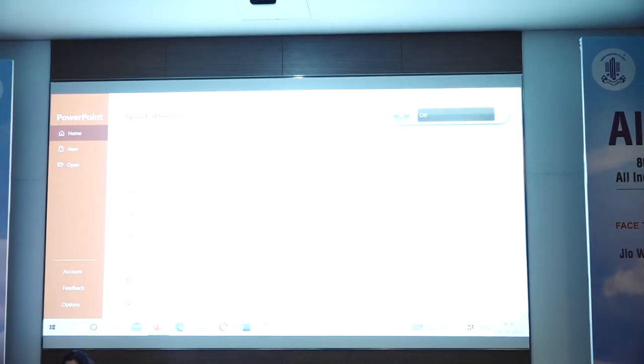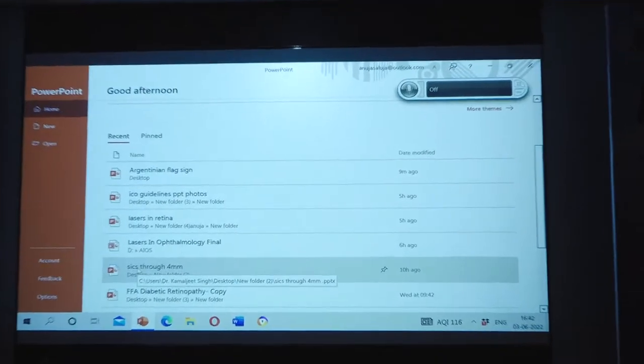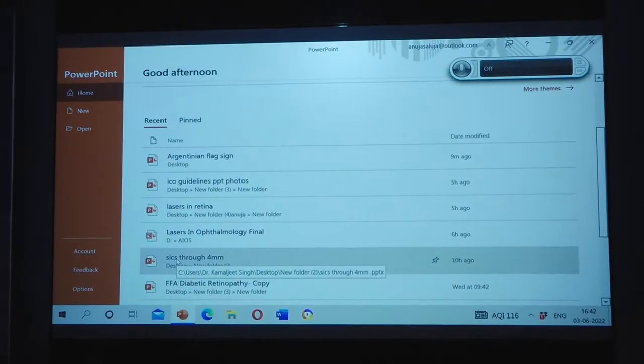And a temporal incision is made, number one, as Madam has told, when there is a bleb, then you go to the temporal side, or if there is a steep meridian on keratometry, say 43 and 46, on the horizontal side, then you make a temporal incision. Greater the astigmatism, the nearer you are to the limbus, so that will correct that much of astigmatism. That can be done easily without any problem.